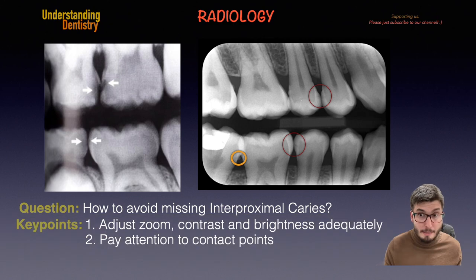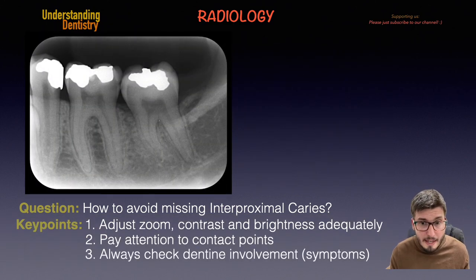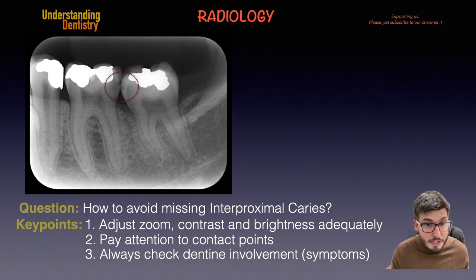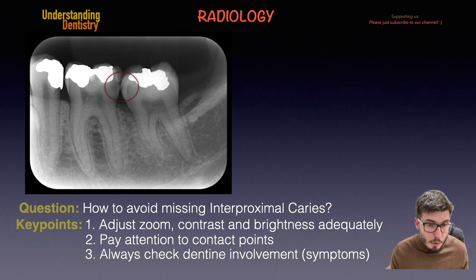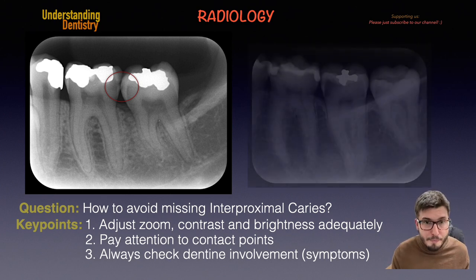In even more advanced cases, we find a pattern where there is a small involvement of the enamel but a larger involvement of the dentin, as seen on the left side of your screen. We need to always check for dentin involvement, and then correlate with the patient's symptoms, as we always need to do.